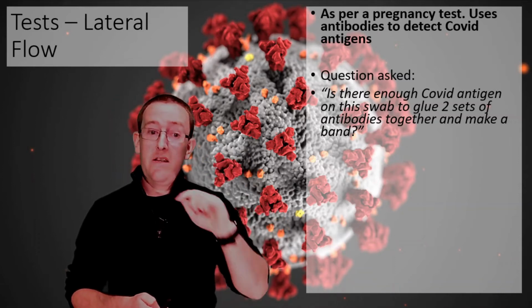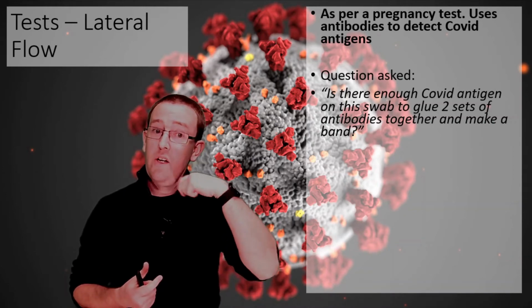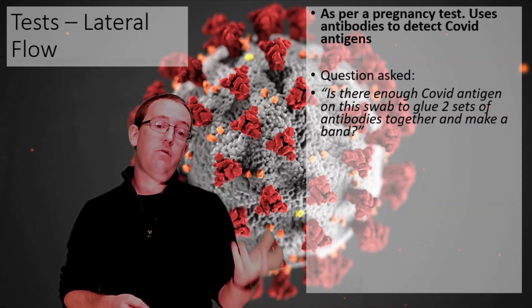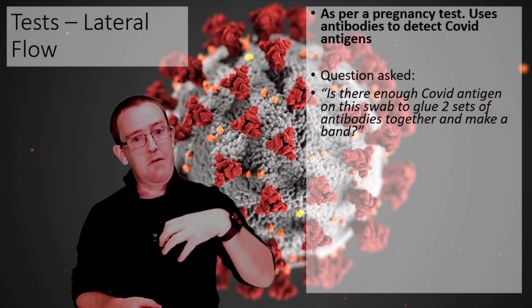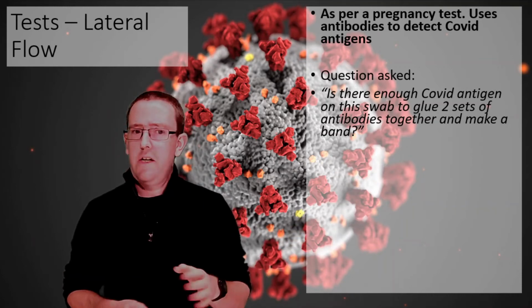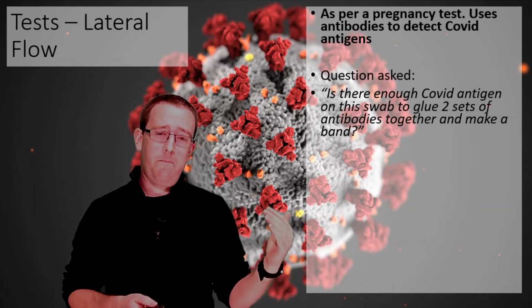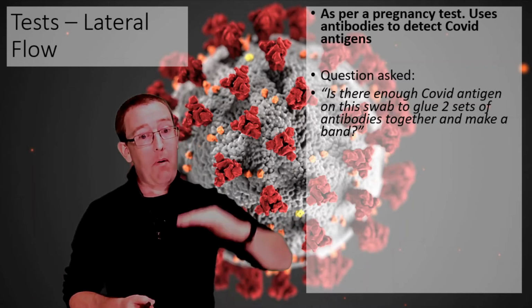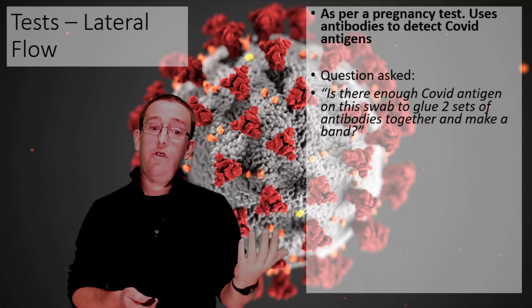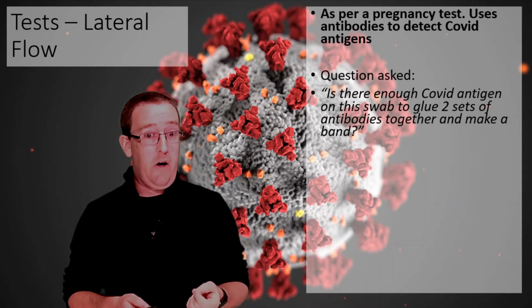The other thing that might happen is that you might not have enough swab. You might have the COVID virus and then you might not have swabbed well enough. There might be user error, okay? Which again is why we're encouraging all our students to do it within school first, so they get the hang of it before they're then allowed to go and do it in the community, to increase the accuracy. And there have been lots of studies on the accuracy, the sensitivity, the specificity of this. And of course it is lower than PCR, but it's actually triggered to pick up a much higher level of COVID, which you could argue is a good thing, that it's not going to give you false positives in the same way as PCR might, okay?